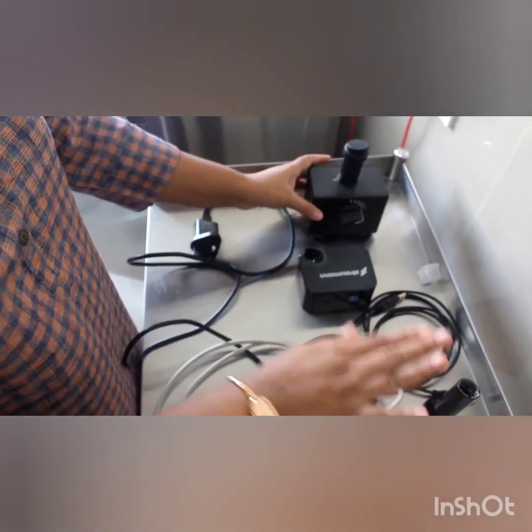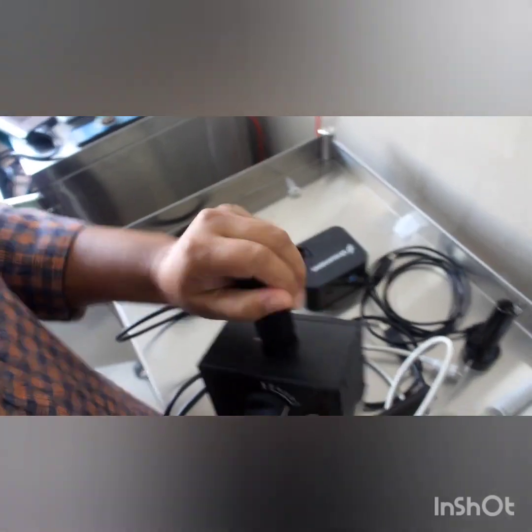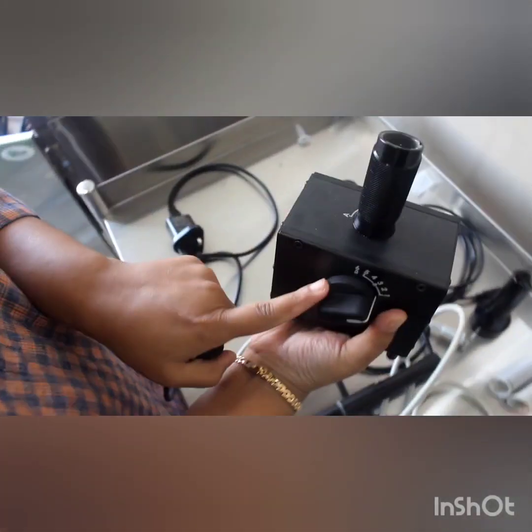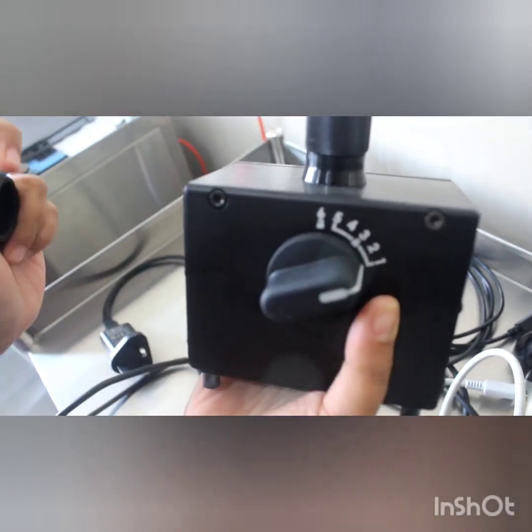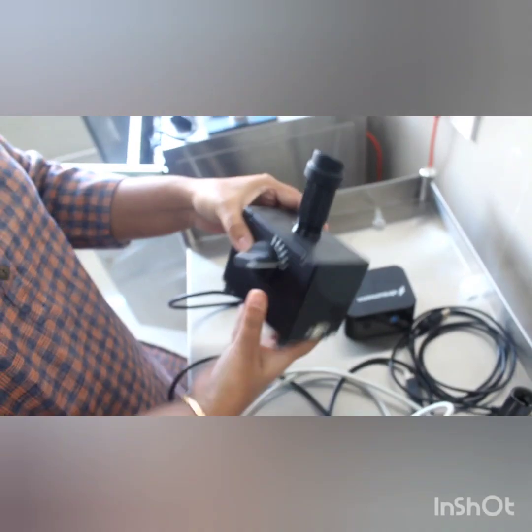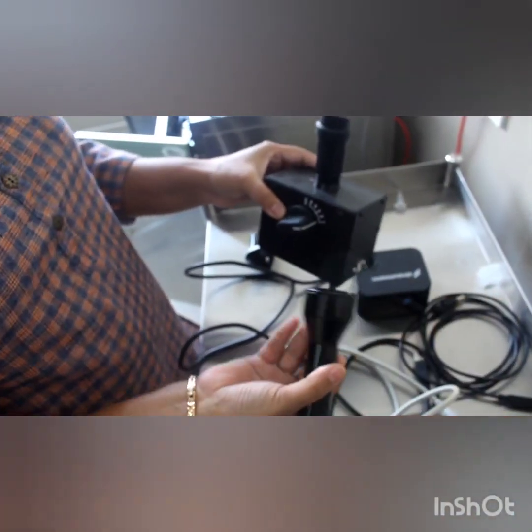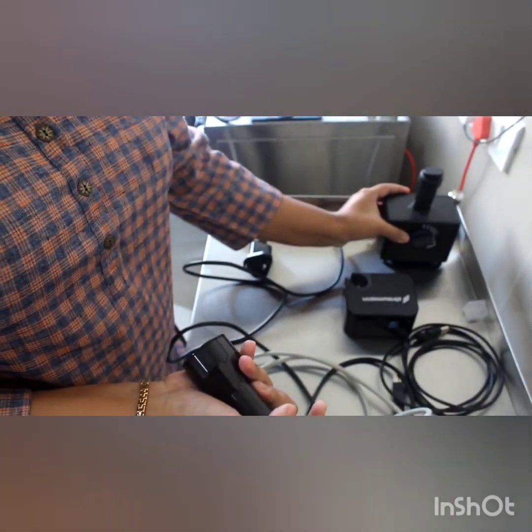Now if the integrity check has failed, you will need to run the proper calibration, which is done through this tool, and as mentioned before, this is called the sharp adjust. So just to recap, you run the integrity check once per week, and if that fails, you have to run the sharp adjust tool.